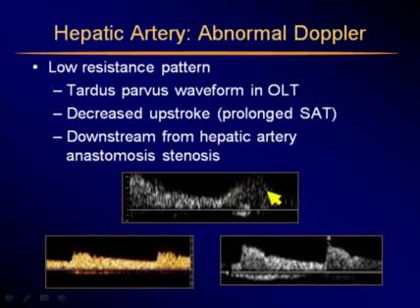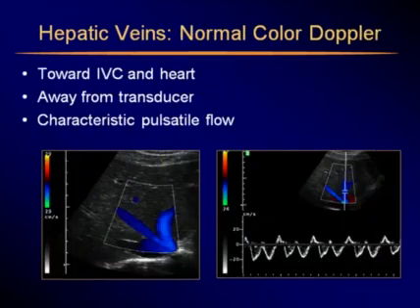So we are not seeing the flow through the stenosis itself, but we are seeing the flow downstream from the stenosis, when the flow has lost energy and is trying to relaminarize and is weak. And that's why we get the tardus parvus syndrome. So we don't actually see the stenosis, we just see the effect of the stenosis downstream in a transplant.